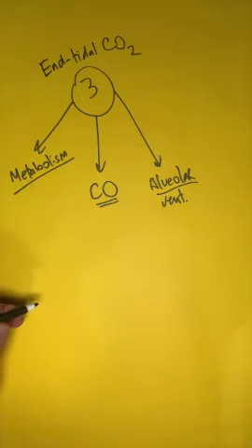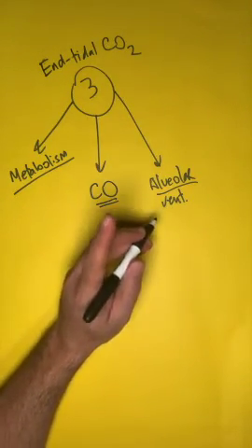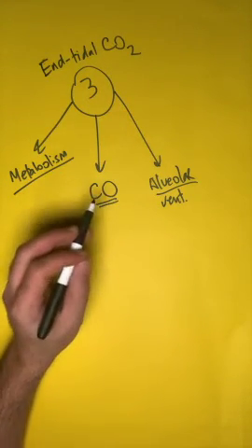Now, anytime you're going to use end-tidal CO2 to monitor any one of these three parameters, you have to remember one thing, and that is, if you're going to monitor one thing, the other two things have to stay stable.